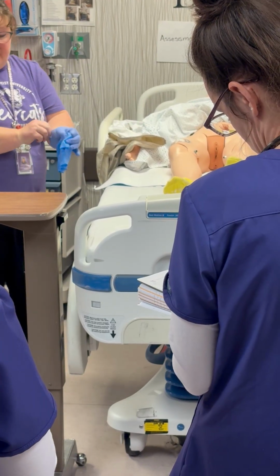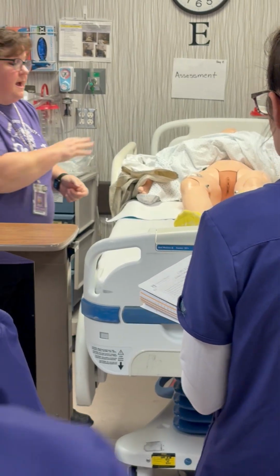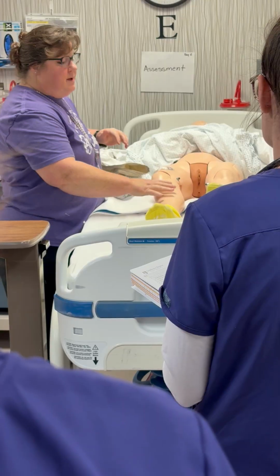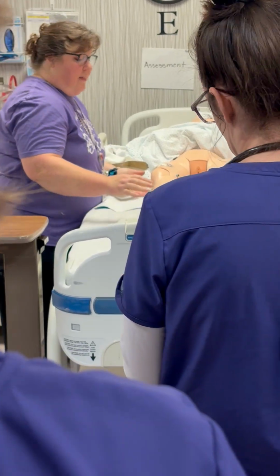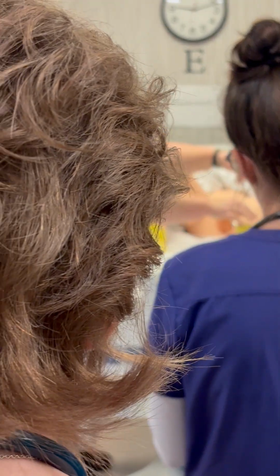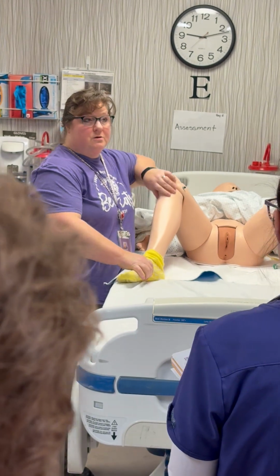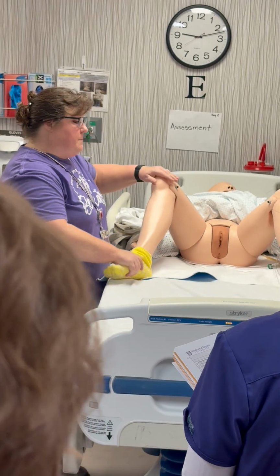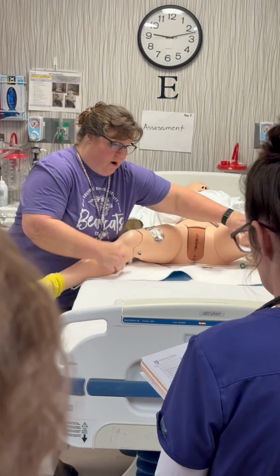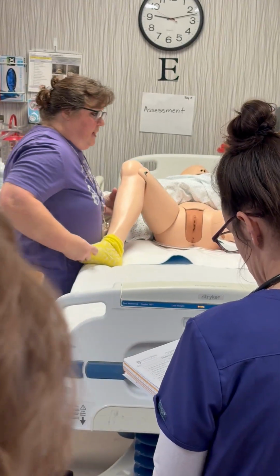So after I've done the pericare, I'm not going to touch it. I'm going to remove my gloves, wash my hands, right? And now I'm going to get started with the Foley catheter part. Okay? So I'm going to put them in the dorsal recumbent position. That means with their knees bent and their feet flat on the bed. Okay? For females, you want their legs as far apart as possible. Okay? Males, a lot of times they don't bend their legs up, they just put them as far apart as possible for males. Okay? But it has to be in that position.